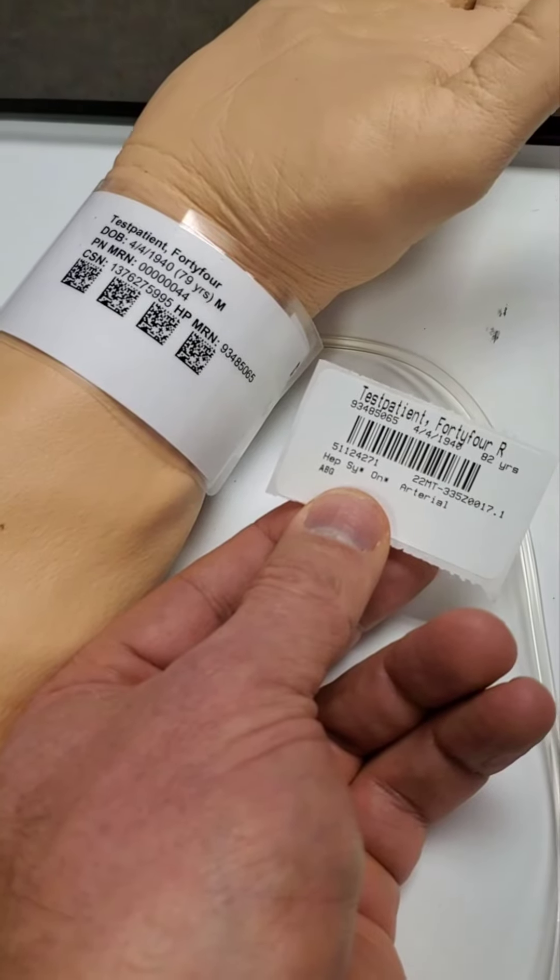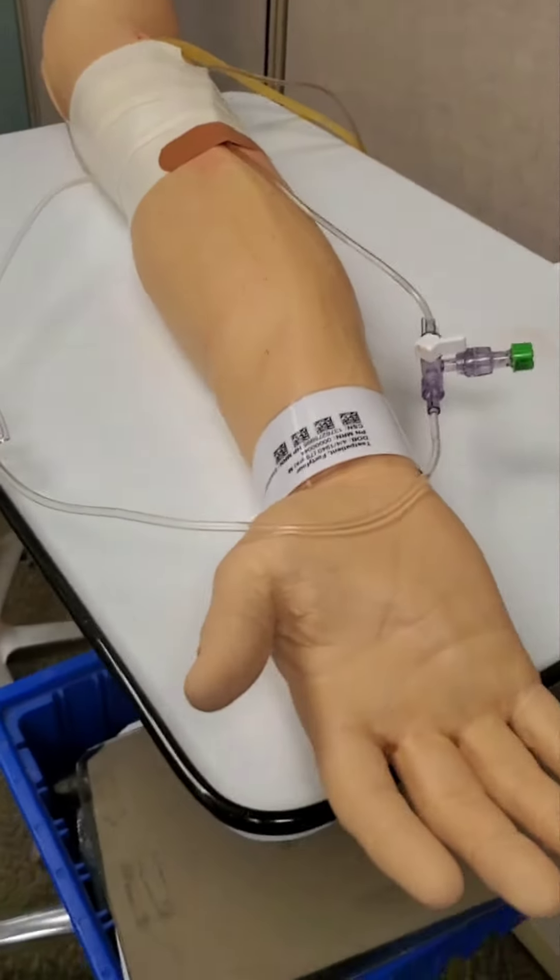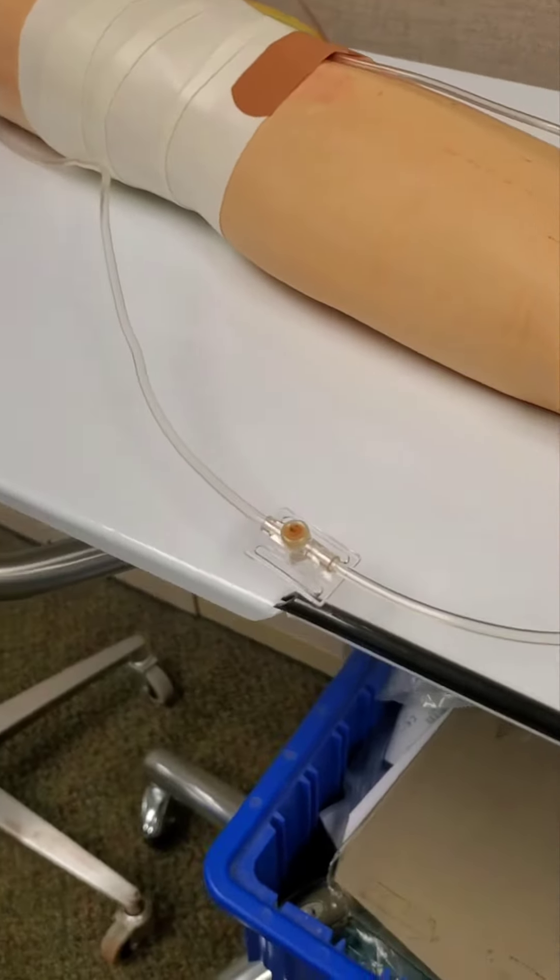Verify you have the correct patient. Find the A-line on the patient and the port from which you'll be drawing from.